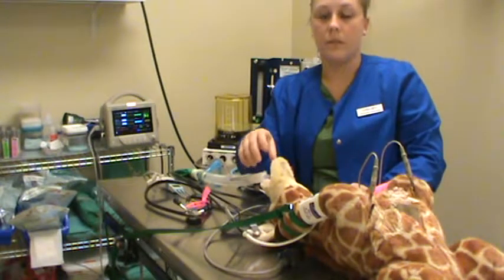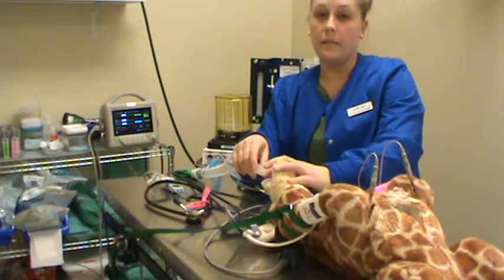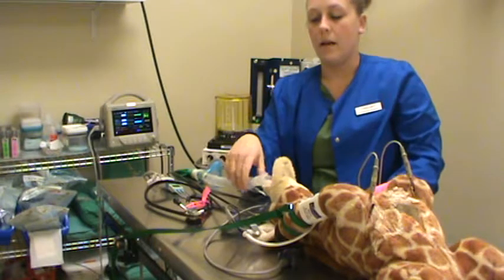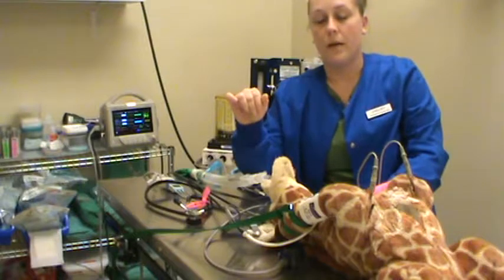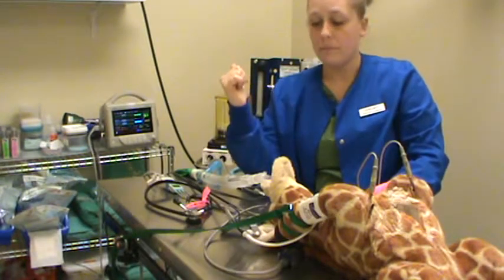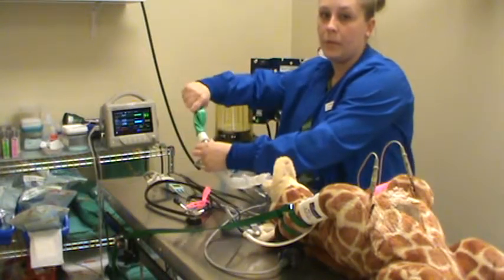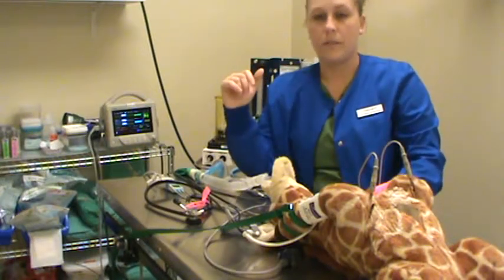It's a really important value to make sure that your tube is correctly in place, that it's not in too far, that each lung is actually expanding. You can use your end tidal CO2 capnometry number to really evaluate a lot of things as far as ventilation goes. So if we're manually ventilating a patient here, bagging them with our little bag, we can tell how well we're doing when we watch that end tidal CO2 number.